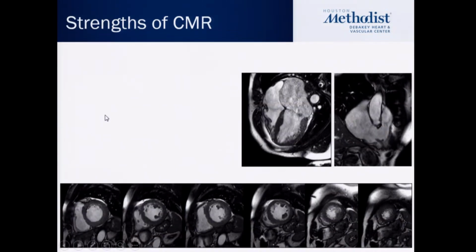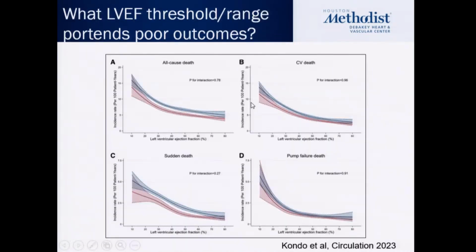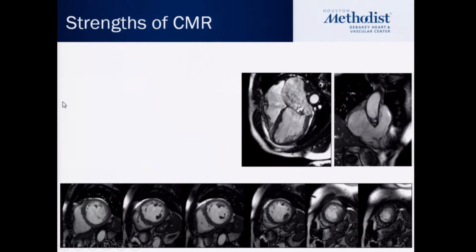So let me talk a little bit about CMR. What I wanted you to keep in mind from the previous slides is that EF also has more caveats, not just with measurements and reflection of LV performance, but also outcomes. And there's more work to be done in this area, I think.